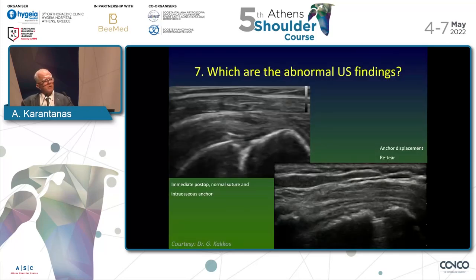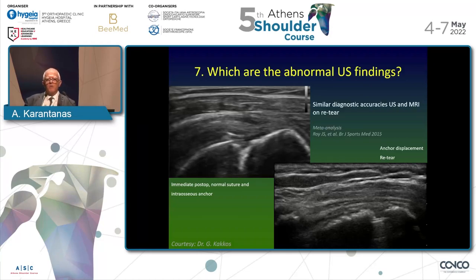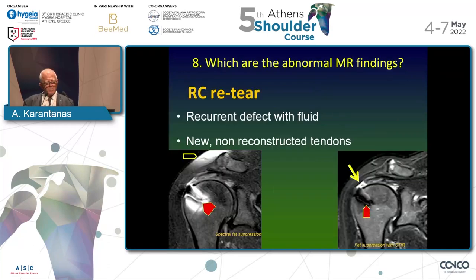Ultrasound is much more useful. Here you see the bursal thickening and fluid with the anchor in the immediate postoperative period. A few months later, we see no anchor in the bone — it has been displaced. We see the retracted tendon, and the deltoid muscle is abutting the bone because there is no supraspinatus there, so we can detect the retear very accurately. A meta-analysis suggested similar accuracy between ultrasound and MRI for detecting tendon retear.